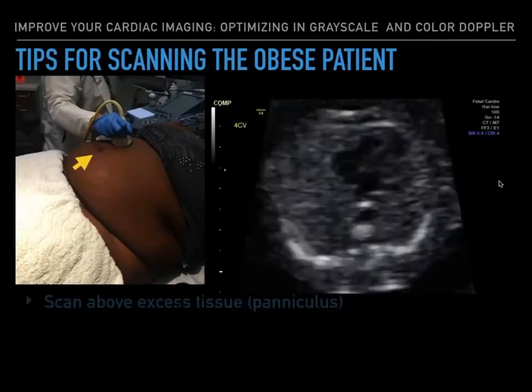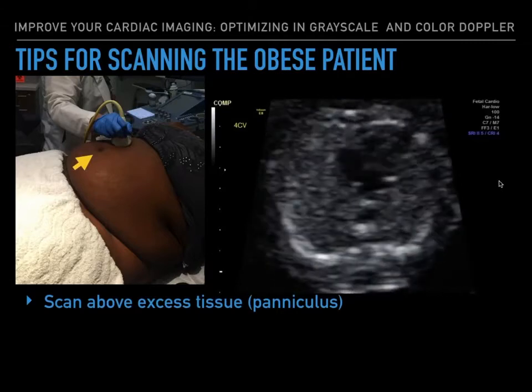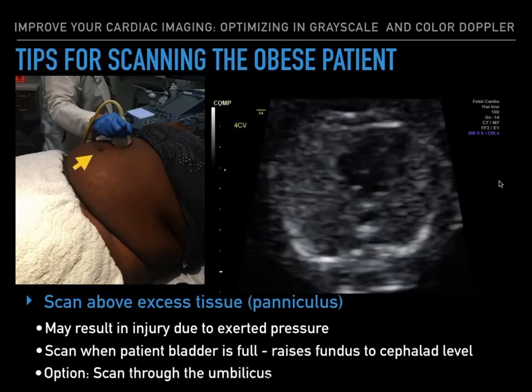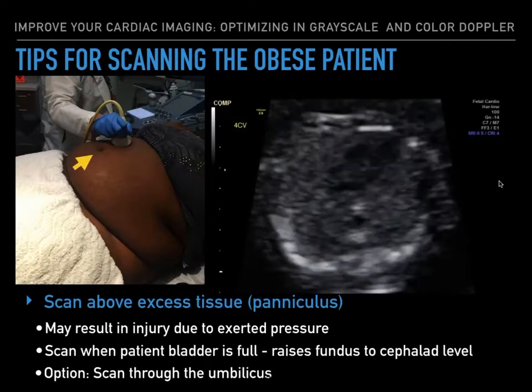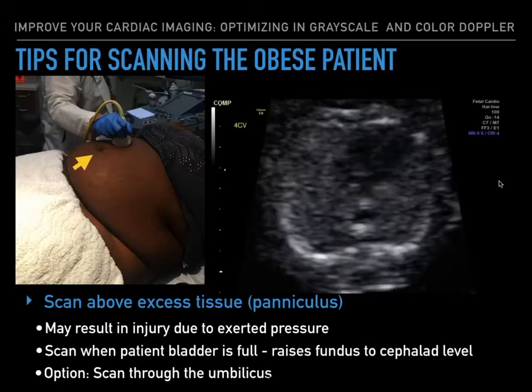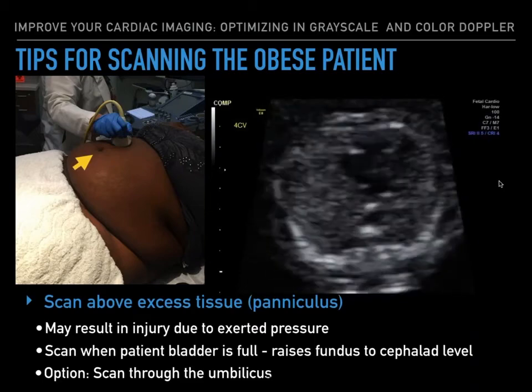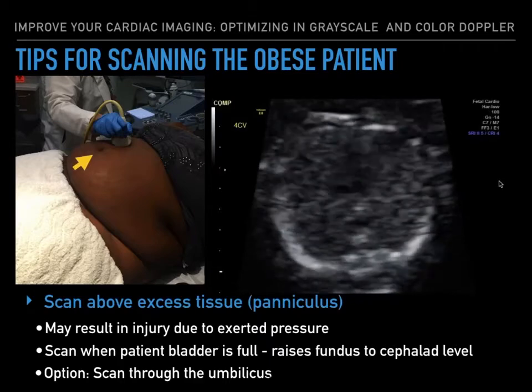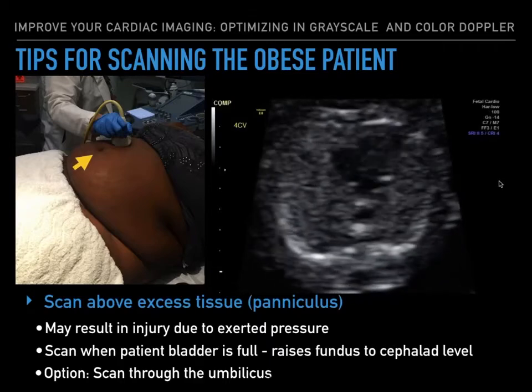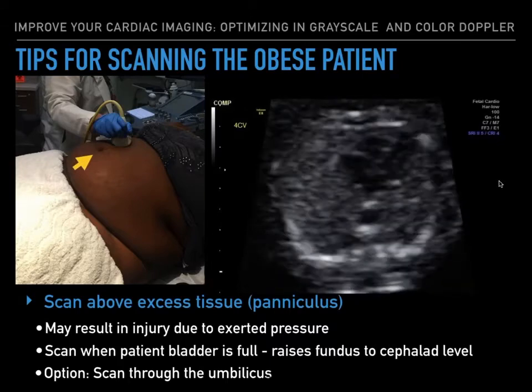Another technique that helps but requires more effort is actually scanning above the extra tissue. This may result in injury due to the exerted pressure that you're applying on top, because you do have that extra depth to penetrate. Another helpful tip is to scan when the patient's bladder is full, as it raises the fundus towards the cephalad level, and thus you have a decreased imaging depth. Another option is you could actually scan through the umbilicus. That would decrease the distance, but most of the time shadowing may occur.